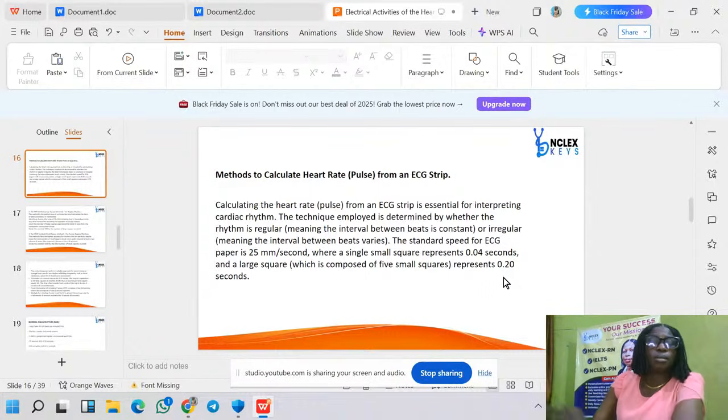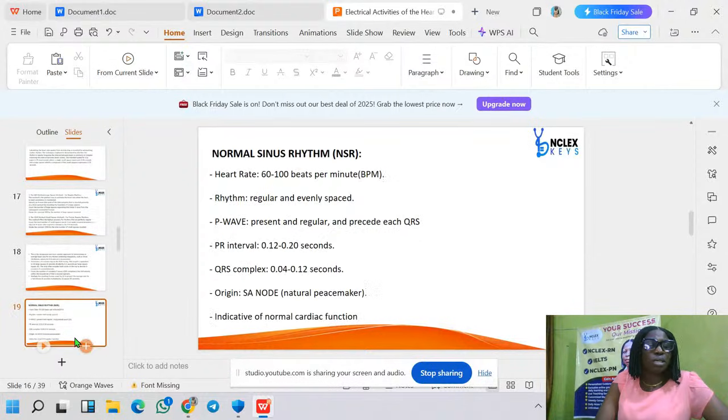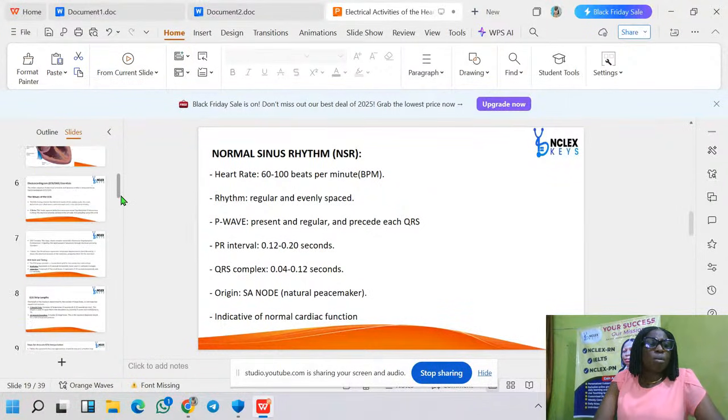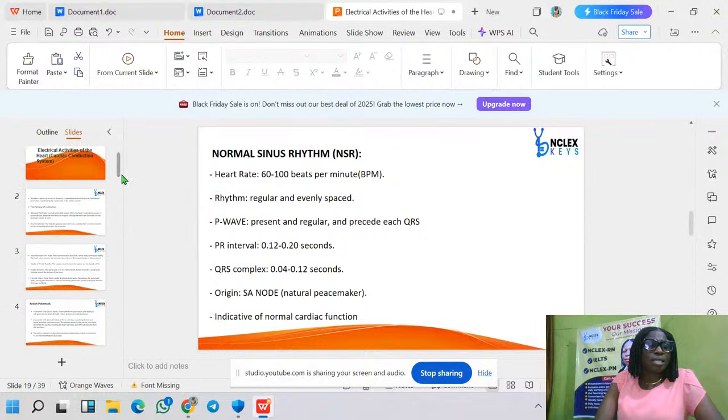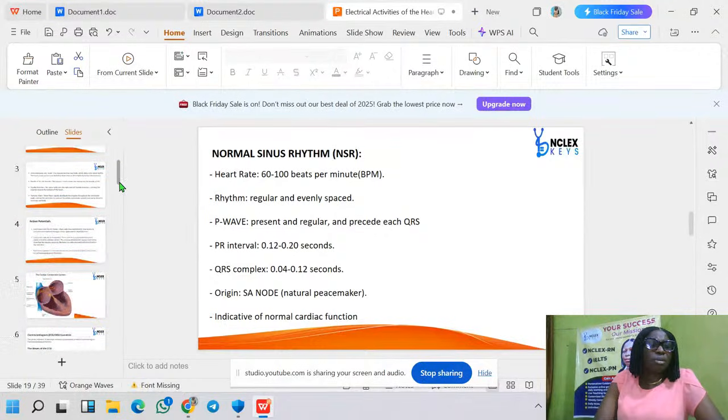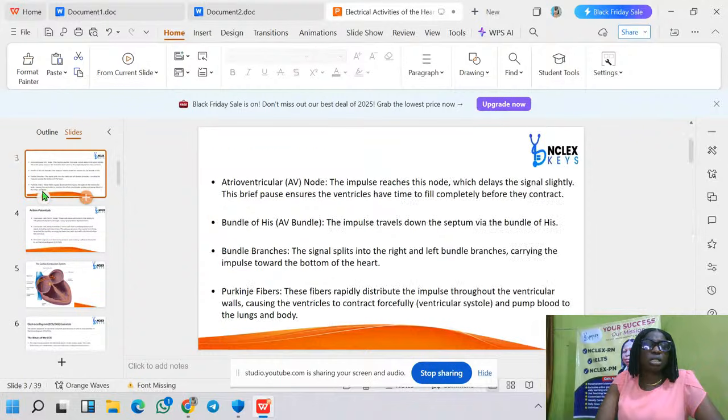Welcome, everyone. Welcome to today. So today we'll be starting with how to recognize normal sinus rhythm.